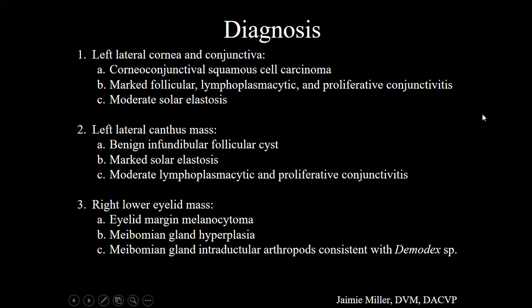A little benign follicular cyst, and then a little eyelid melanocytoma that's sort of blending with some hyperplasia, causing a mass effect, and some incidental Demodex. Where's the horse from? Utah. Okay. From Utah.